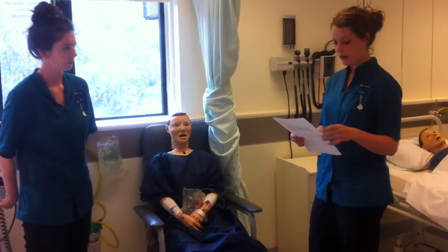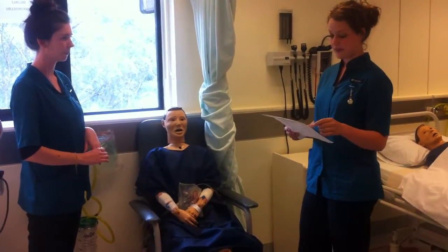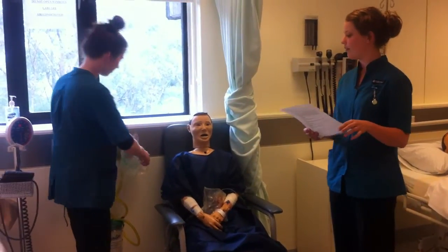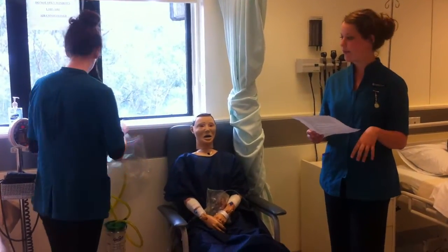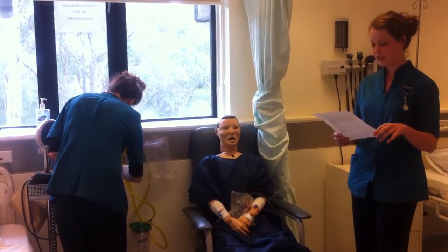So Penny will now gather all equipment to deliver oxygen therapy. Mr. Saunders requires 3 litres via nasal prongs as stated in the handover. We need to remember that oxygen is a nurse-initiated medication, so we need to be quite careful as to how much we're giving, with close assessment when we're doing this.